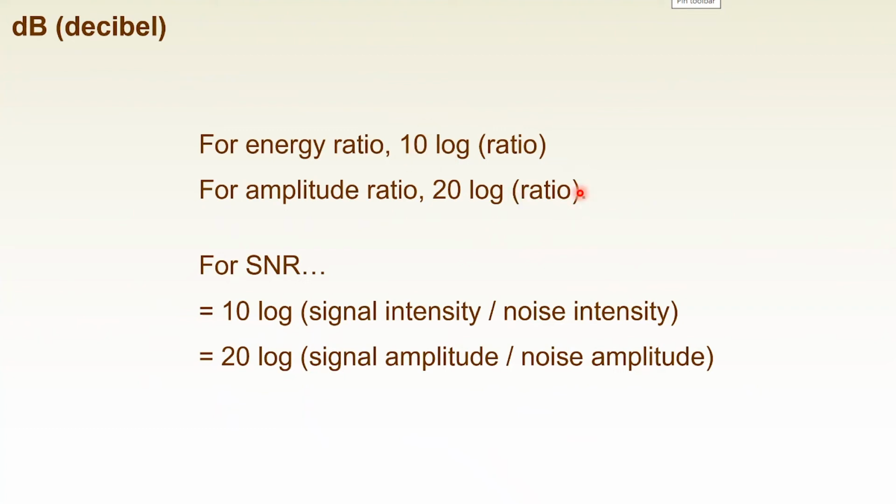And if you define a ratio as an amplitude ratio, you should use 20. Essentially, these two equations are the same, and there is no ambiguity. In old literature, it sometimes claims there are two definitions of sensitivity in OCT. One is defined in 10 log 10, and the other in 20 log 10 or something. But actually, that understanding is incorrect.